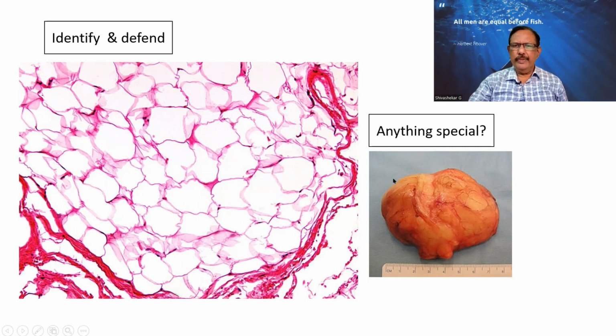This is a tumor. And on the surface of it, it is covered. Are you able to see some lines over here? These are blood vessels. That is how we make out a capsule. A capsule is a covering for a tumor or anything. That capsule is seen over here. Look at this band of thin collagen. That is a capsule. So when there is fat tissue with an intact capsule, it becomes a tumor called lipoma. So lipoma is a benign tumor arising from the adipose tissue.